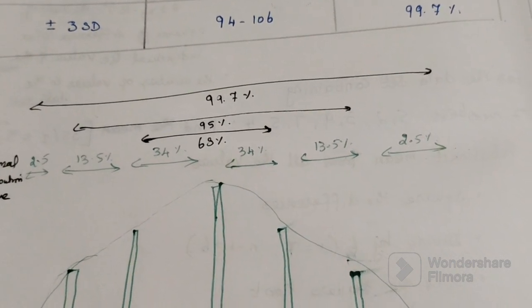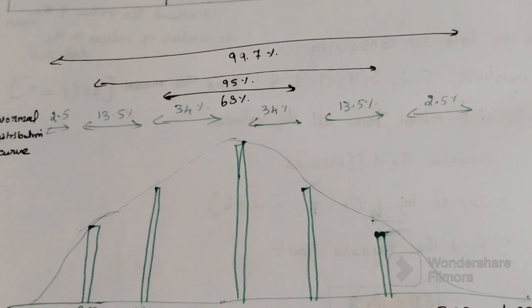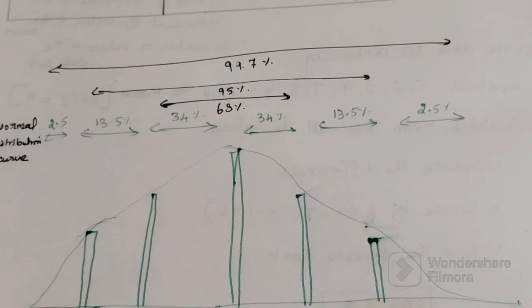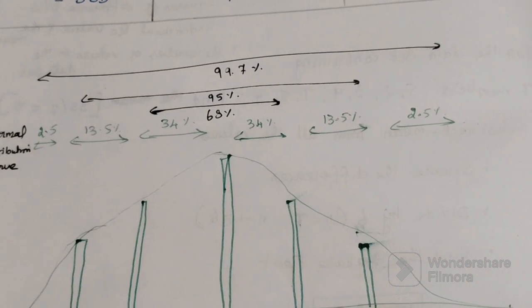That is why these properties are used to monitor the stability of an analytical system.